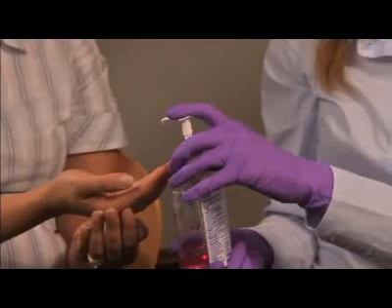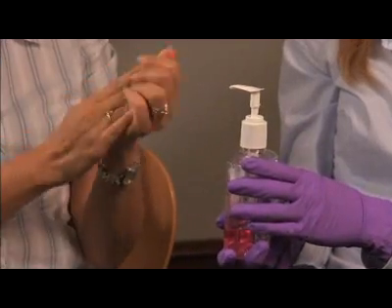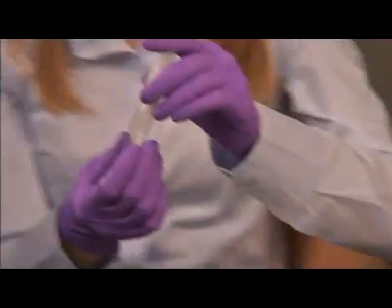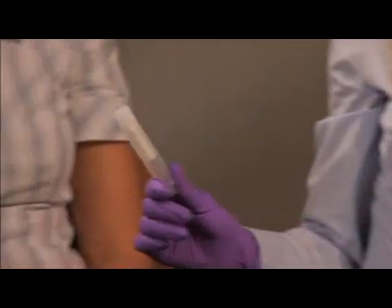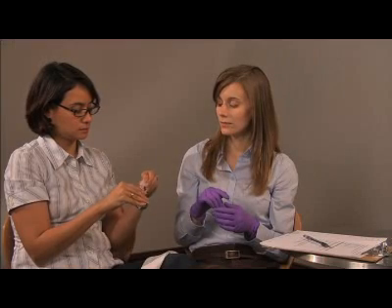First, I'm going to ask you to clean your hands a little bit. Have the participant wash their hands with antimicrobial hand sanitizer before handling the cotton swab. Inform the participant to remove the cap of the sample tube and place the sterile swab directly into his or her mouth near one side.